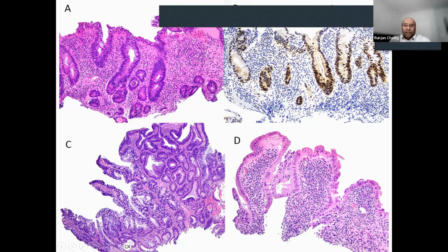This is the p53, and the p53 really has been a revelation, especially in Barrett's esophagus, but can be deployed in IBD as well, because mutant expression, and by mutant expression, I mean really dark brown nuclear staining, not just a blush. Even this in certain parts is a little bit difficult to interpret, but when it's dark brown and obvious in the areas of suspicion, you can feel confident that there is dysplasia there, low-grade dysplasia.